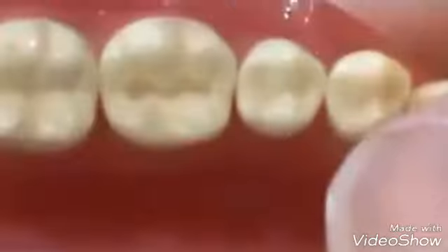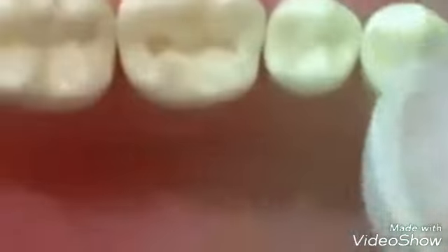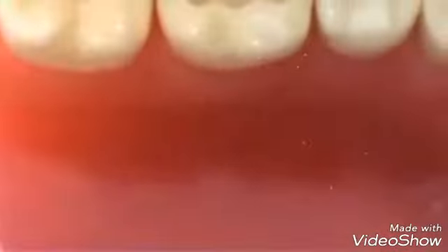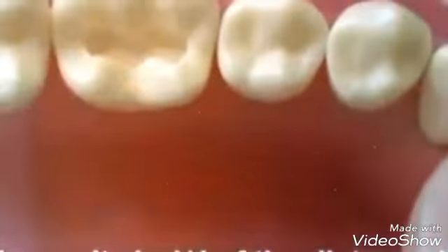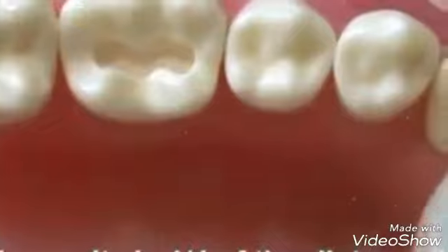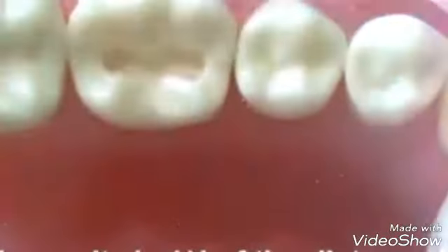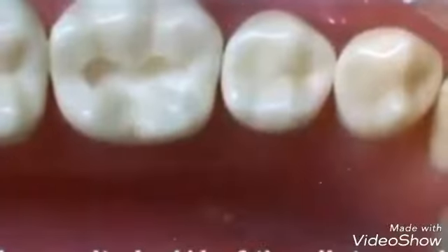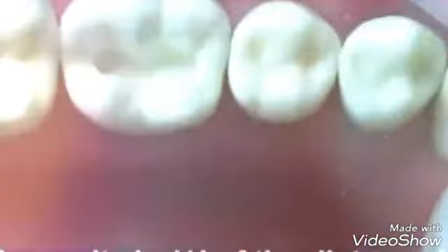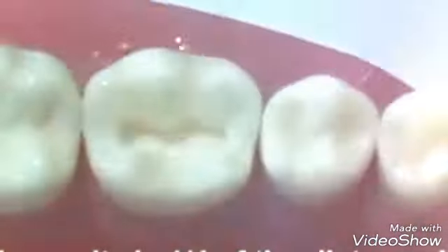This is the cavity after we complete the outline form and the retention form. The width of the cavity buccolingually is about 1/4 of the distance from the buccal to the lingual cusps.